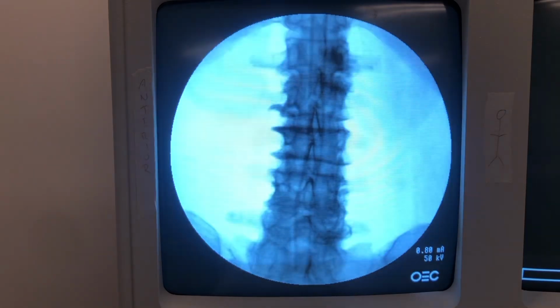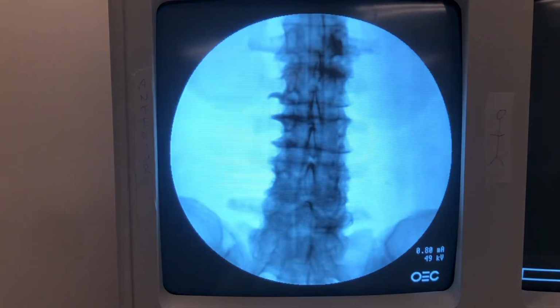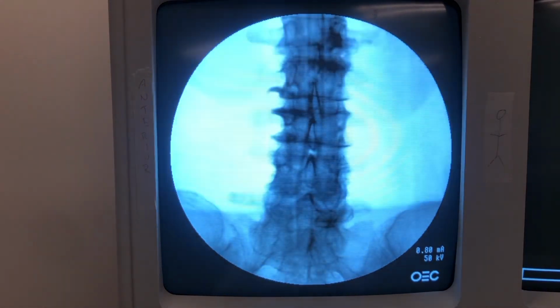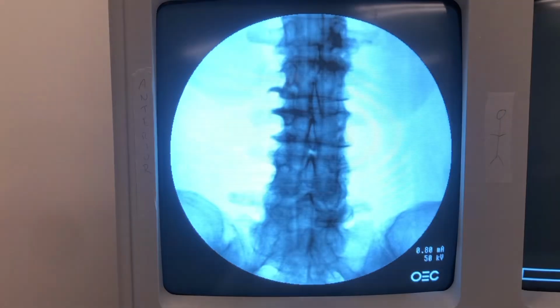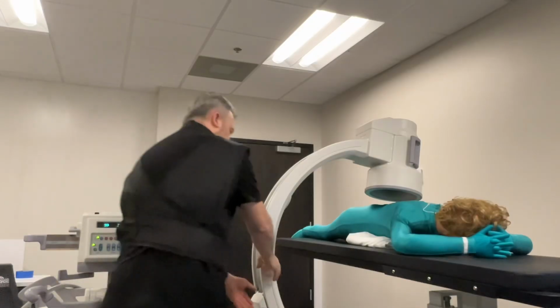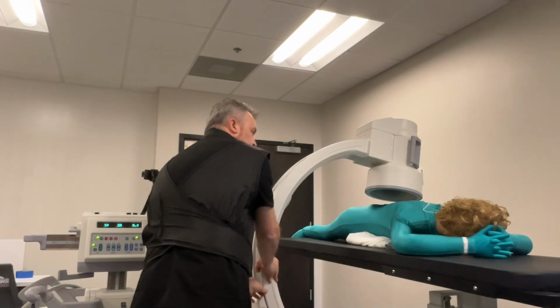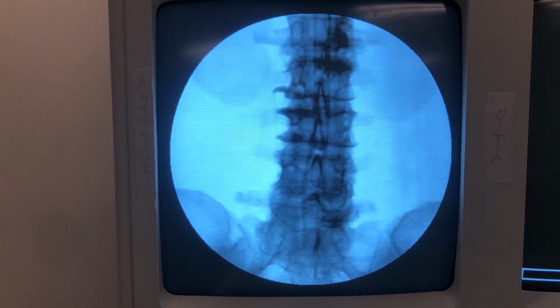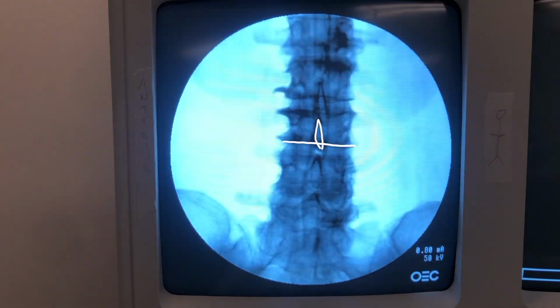Sometimes you have to go the other way to confirm that your correction is correct, or to go so far that you can definitely see that it is not the right way. So here we can actually see a better alignment of the bottom. And whichever one, it doesn't matter, top or bottom, because your body is essentially centered anyway. So here we just want a little piece of tilt, or a little bit more overscan, just to bring that spinous process leaning back into the center. And there we go then.